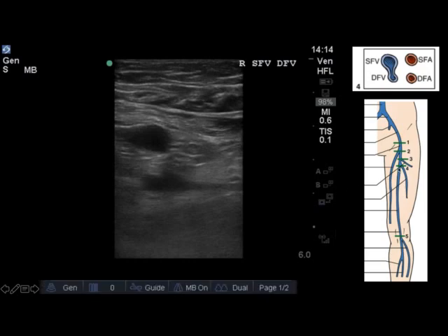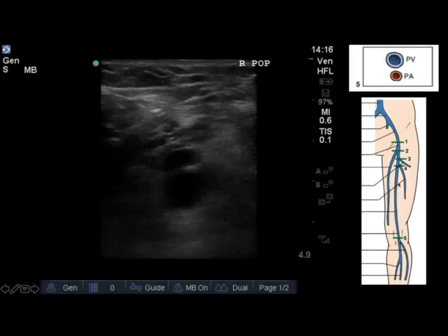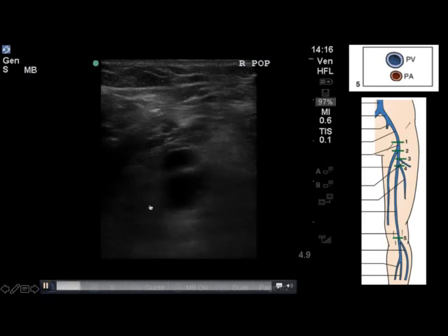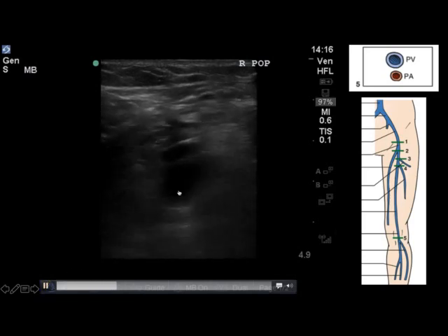Again, you're going to move along the superficial femoral vein, examining and compressing every one to two centimeters, satisfying yourself that there is no clot present, until you get to the most distal and fifth and final point of vascular bifurcation which lies in the popliteal fossa.